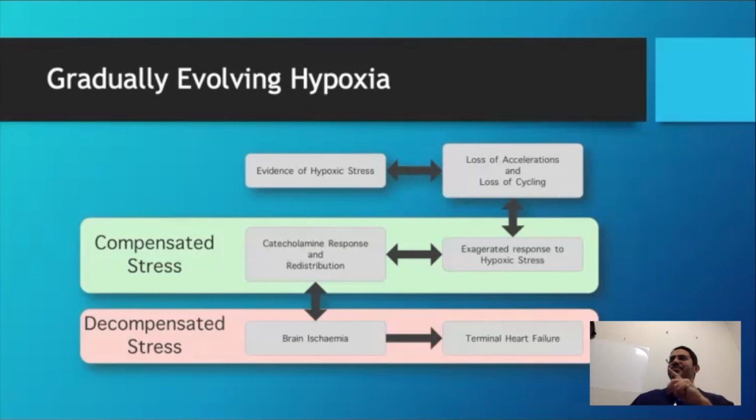So the only missing point is that you need to have enough time at the baseline. You have a stable baseline and you're spending enough time at the baseline. If you're spending less than 50% at the baseline, that's not stable enough. So it's a normal baseline, normal variability. It's showing some cycling potentially, but that's not a requirement, because the baby can be active all the time, and that's not bad. But it's spending enough time at the baseline. Then you can allow the machine to work, as in, carry on, look at my baby and tell me whether it's becoming hypoxic.